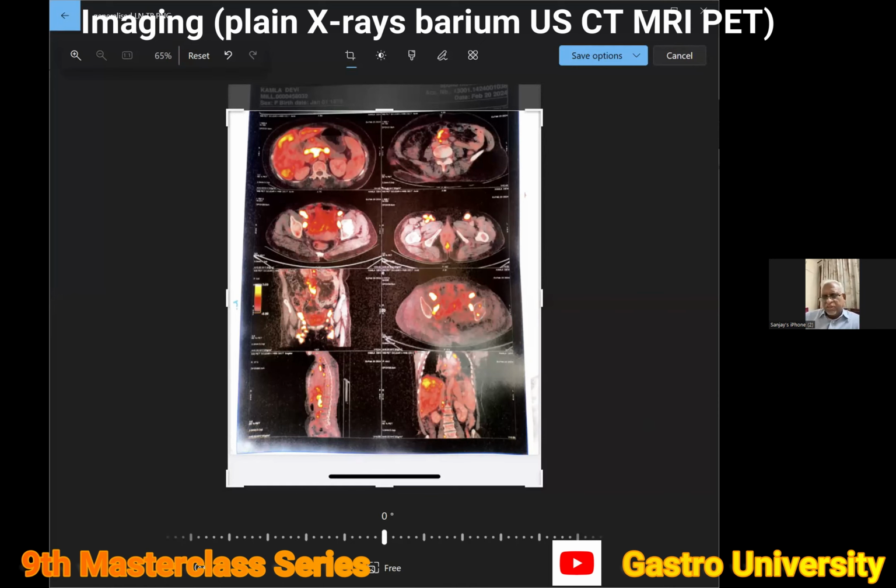Whether some resistance test is done right at the beginning of the treatment regimen or not, some patients don't respond. So these are 2-3 points: multiplicity of the organ involvement, the point from where to take the biopsy, and follow up of the patient. We have found it to be very useful. And of course, PET also does a CT. So the distribution of nodes which are very active, along with their position or necrosis, everything is obtainable in one test. So these are my comments.